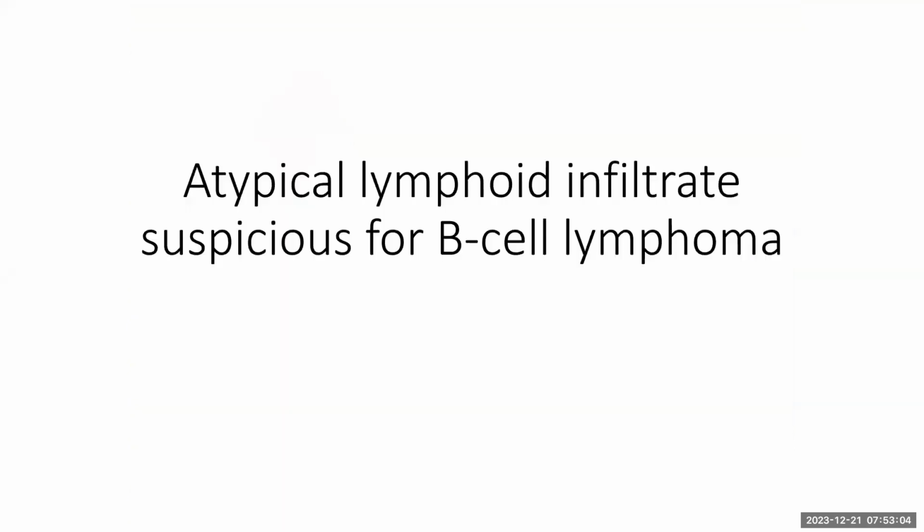Anything else there? Yeah, so the reason why this was a hesitant diagnosis is that I don't know why, but the tissue is not really high quality. Something happened to the tissue somewhere between the OR and the pathology department, and maybe it wasn't fixed well.